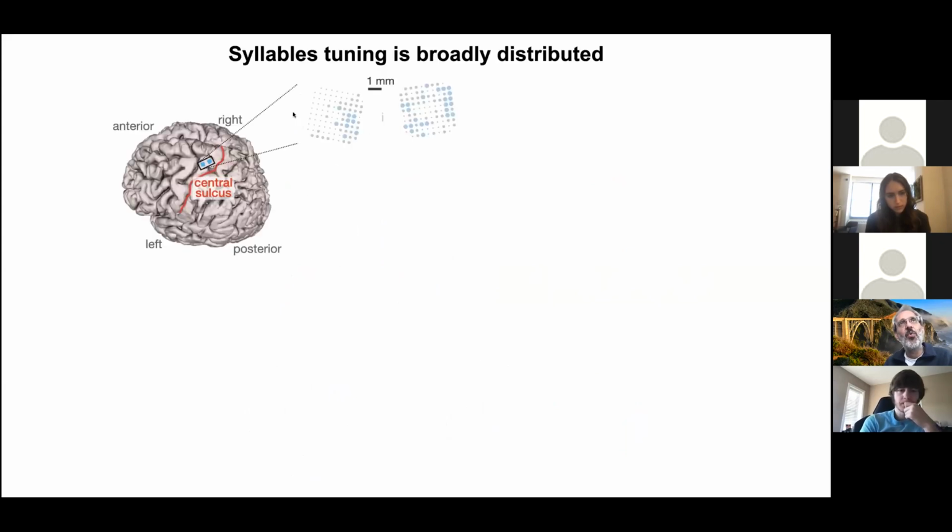is what electrodes are modulated when saying the phoneme I? Well, all these colored in blue. So this is a very sort of same motif we often hear, right? It's a very distributed code. Many, many neurons across many millimeters, probably, actually even across centimeters. And this is probably a centimeter dorsal or medial to where you even ought to find speech motor cortex. This is all motor, right? We're not talking about actual conceptual language. We're talking about the production of language, right?